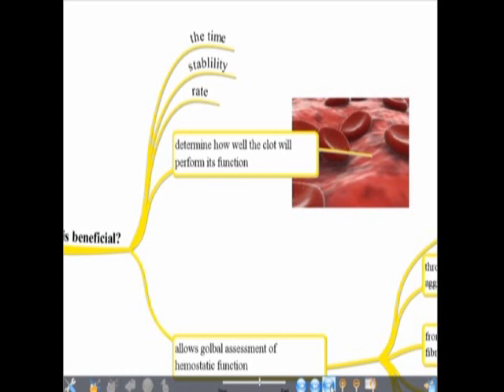Ask the machine to add an enzyme called heparinase, which counteracts the action of the heparin in the sample. So, patients on a filter, let's say, on a bit of heparin. You put this heparinase in the machine. It'll give you a trace of what the blood would be like without the heparin.